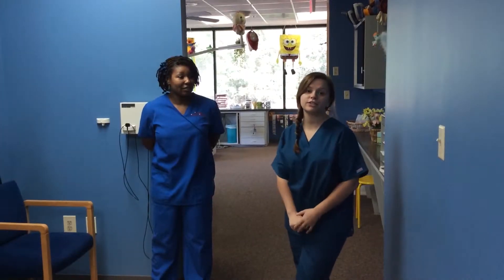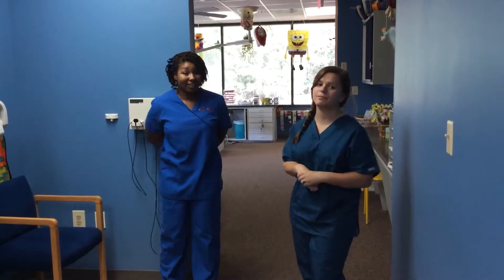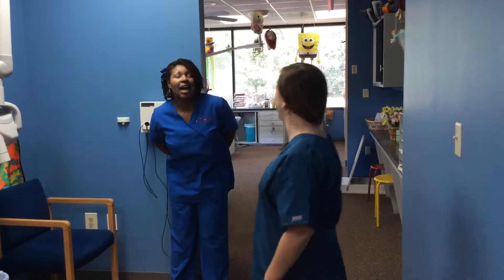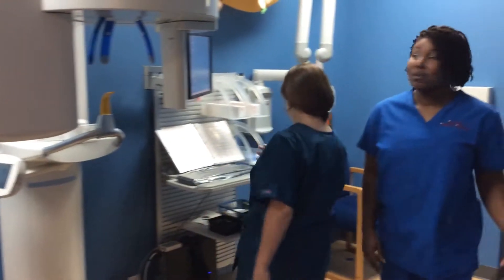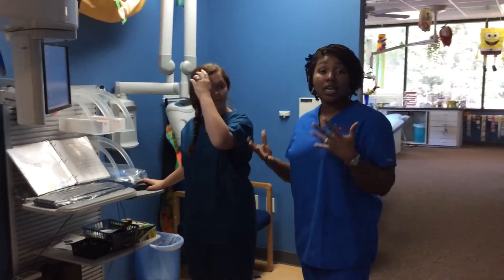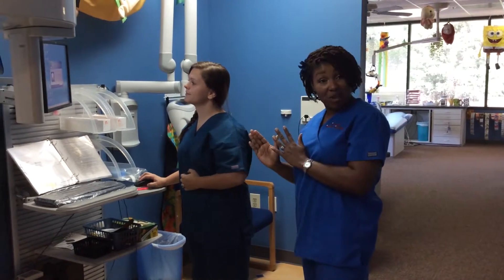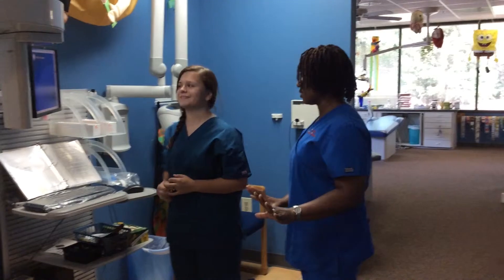We just did a panoramic x-ray where I attempted to do one on myself with the help of Ms. Robin, but now I am going to do one on Ms. Robin, or at least halfway do it. She doesn't want to take off her earrings — it's not that! I've already had my panoramic x-ray this year. We want y'all to see how it's done on another person. She's going to do everything the same way, except now she's going to do it on me, except she's not going to really do the x-ray.